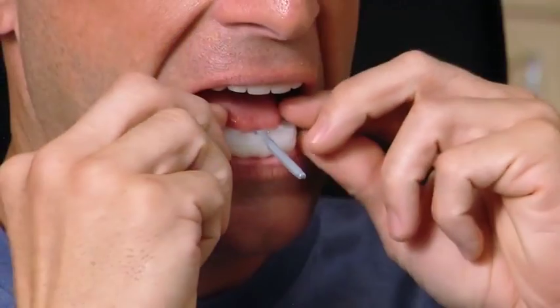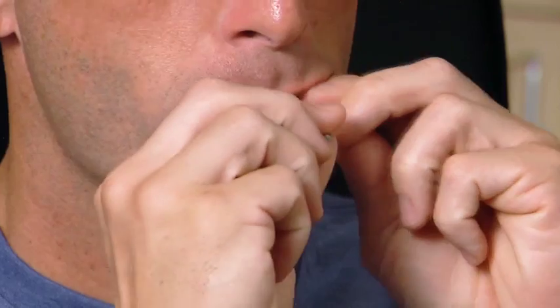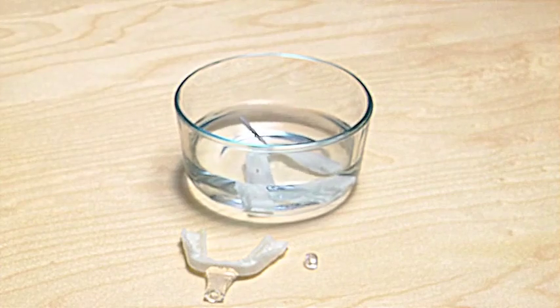To remove the lower tray, place your fingers on the bottom edge of the tray on both sides along the molars and push upward. The tray may be slightly loose, but it will continue to tighten as it cools. Run the tray under cool water or place it in a bowl of cool water to speed the cooling process.